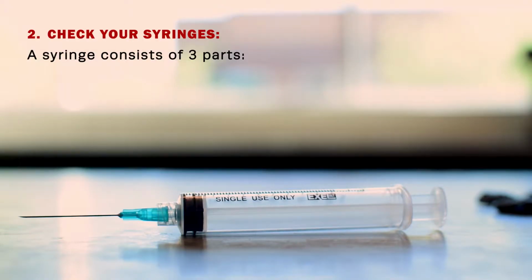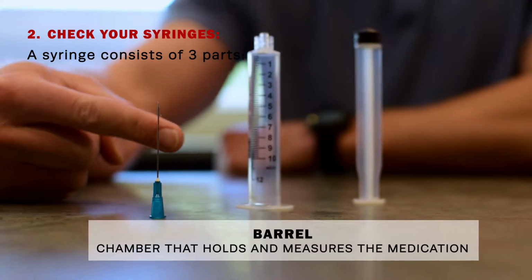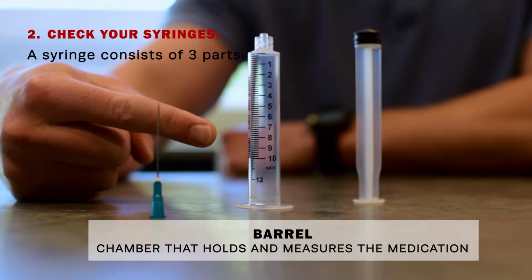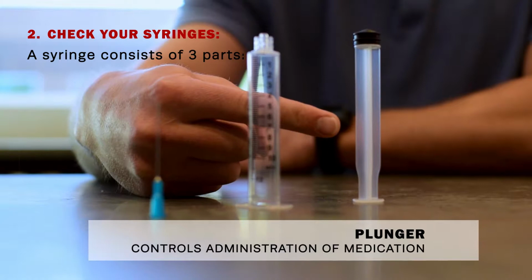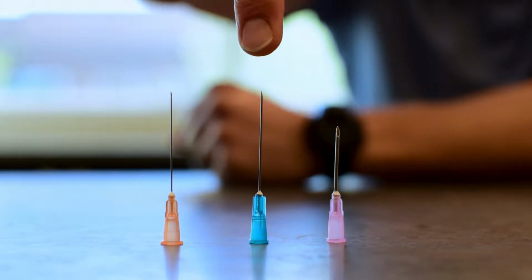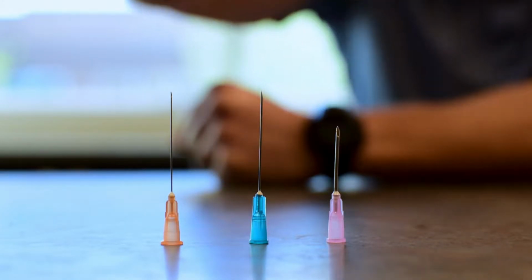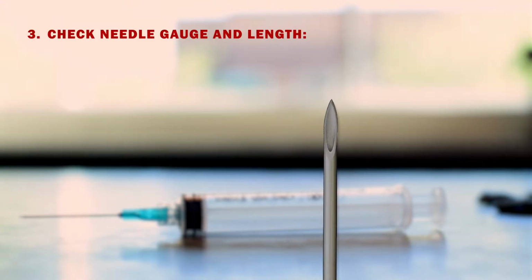Now it's time to check your syringe and needle. A syringe consists of 3 parts: the needle, the component that pierces the skin and inserts into the muscle; the barrel, the chamber that holds and measures the medication; and the plunger, the component that controls administration of medication. The needle size will vary depending on the size of the patient, the IM injection site, and the medication to be used. Be sure to check the needle gauge and length.